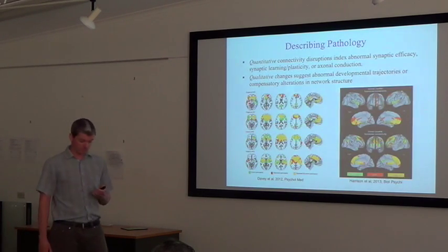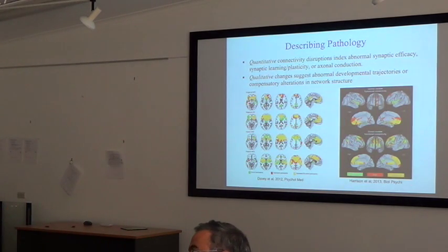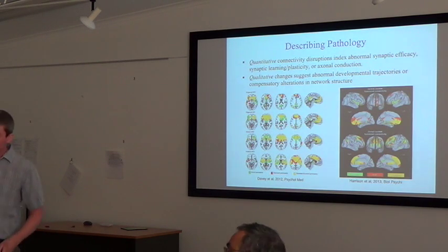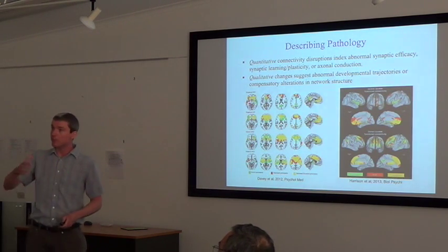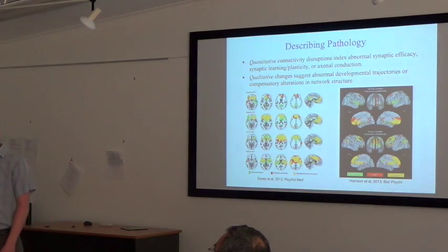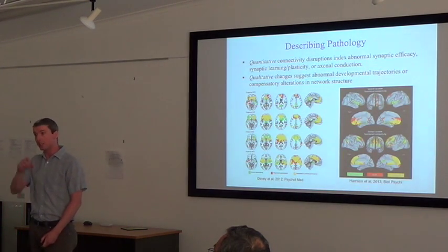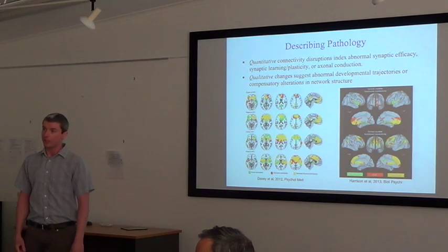So even in the resting state, there needs to be a change for it to be indexed to other regions. We still measure over time. We still use a repeated measures design. We collect hundreds of measurements across our 6 or 10 minutes, and then you're using the spontaneous fluctuation, spontaneous change in the brain signal, and correlating that instead of a particular task signal.